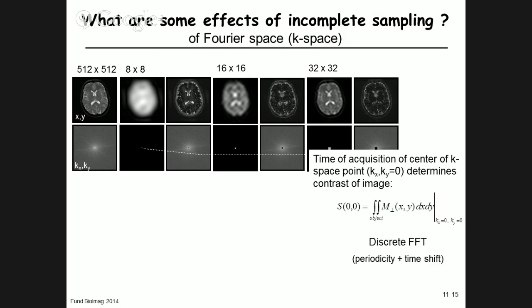So we can time shift in a discrete Fourier transformation. Our echo that's recorded is equivalent mathematically to this. We just time shifted the entire signal by half the window that's been acquired. So this part here will now appear on this side of our discrete data set. That comes from the discrete Fourier transformation. So that's equivalent.